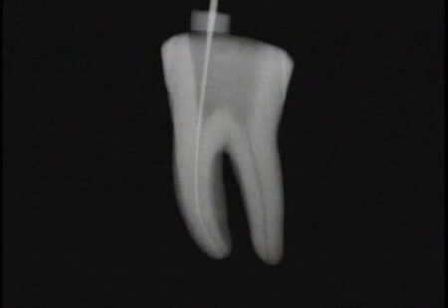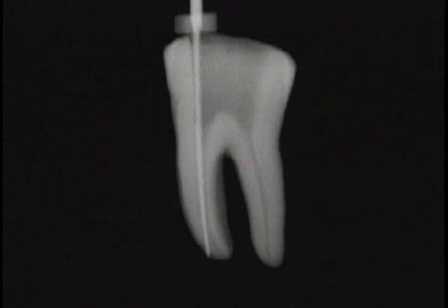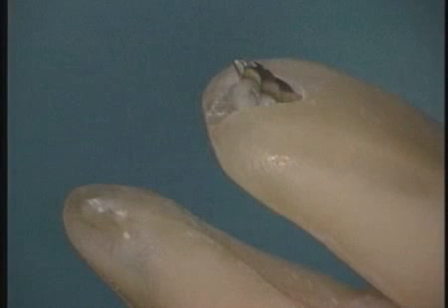Let's look at the development of a Type 3 transportation. Initially, smallest, most flexible files follow the pathway of curvature to the terminus. However, carrying larger, stiffer files apically move the physiologic terminus and relocate it on the outer wall of the mesial root. These iatrogenic events are not conducive to conventional treatment and regretfully will require surgery to correct.